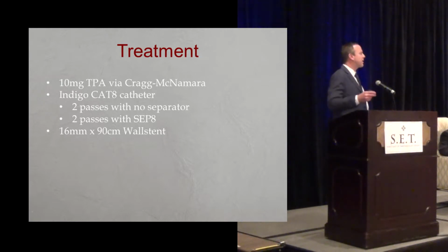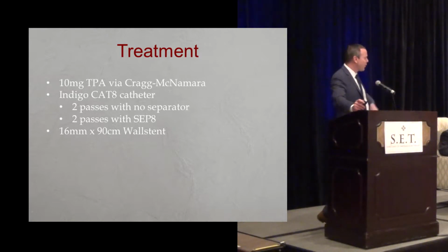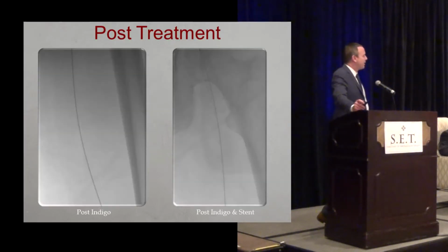If there's still clot there when I go in the second pass, I will then use the separator to clean out the distal tip. But most of the time, I go without the separator. Then we fixed her distal outflow. Now this is what we get here. This is post-procedure in the femoral segment. You'll see here that we then stented the outflow with Wallstents with a very nice result.